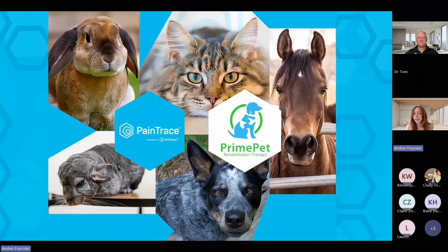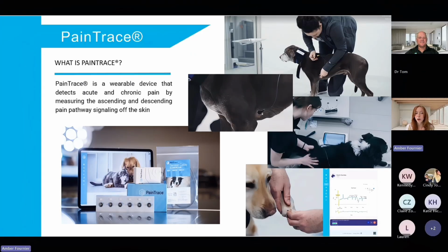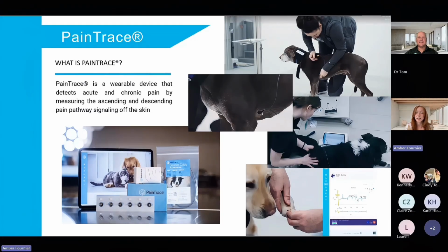Where are the sensors placed again, and does this impact where the pain is tracked? So I'll go back to this slide here. So the sensors are placed in the axilla for canines. So it is a species specific location, but for canines and felines, it's in the axilla. And this does not impact where the pain is tracked.